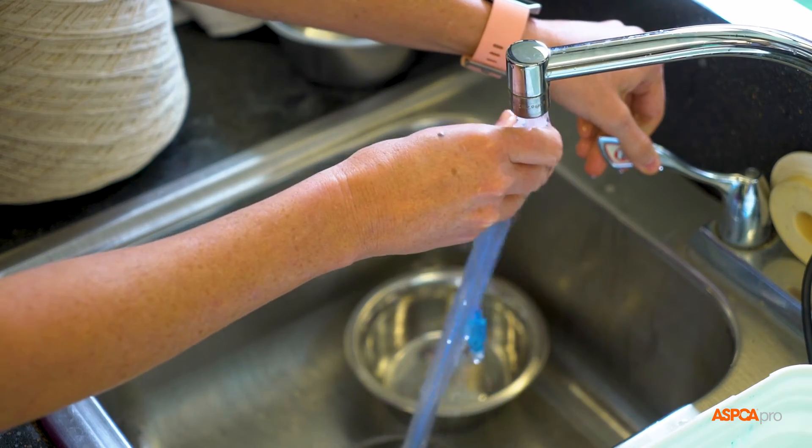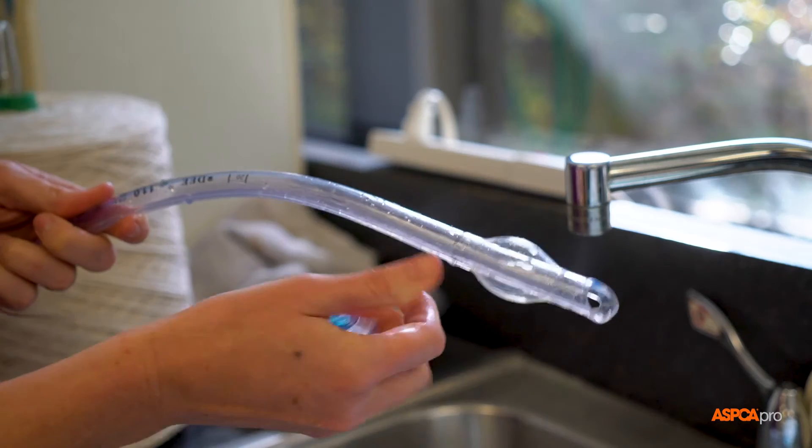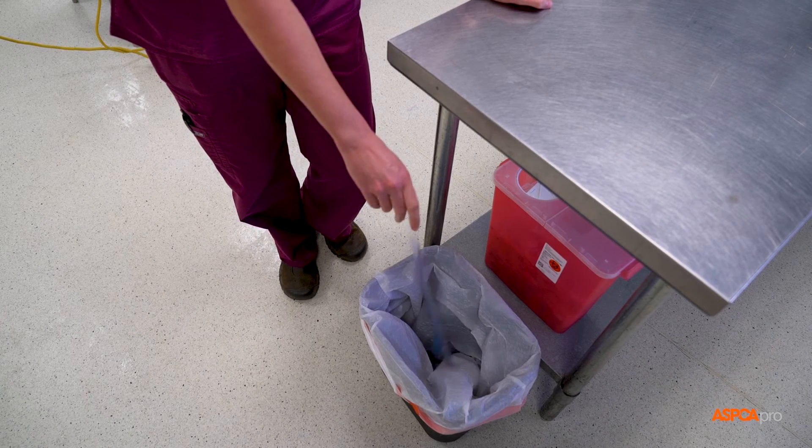Cleaning is also the best time to test all endotracheal tubes for defects. After all the soap is rinsed off, check the cuffs for integrity. Throw the tube out if water has collected inside the cuff or it has stopped holding air.